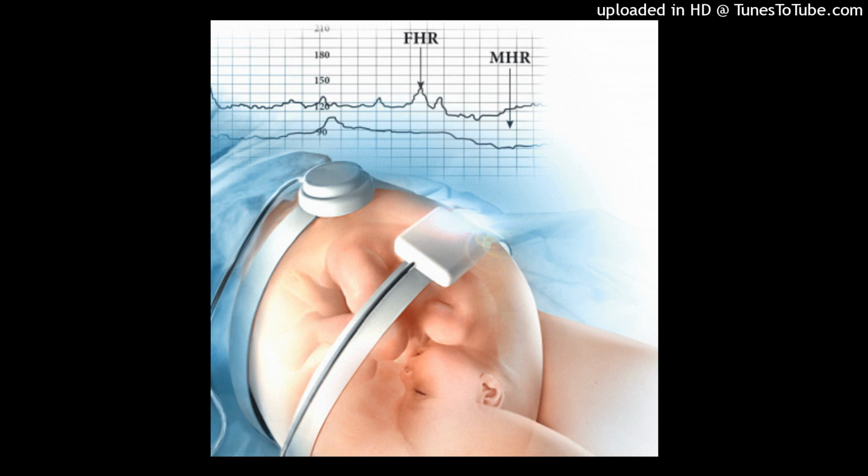Baseline fetal heart rate variability. Baseline FHR variability is determined in a 10-minute window, excluding periodic and episodic changes. Variability is defined as fluctuations in the baseline FHR that are irregular in amplitude and frequency. These fluctuations are visually quantitated as the amplitude of the peak to trough in beats per minute. Variability is classified as follows.